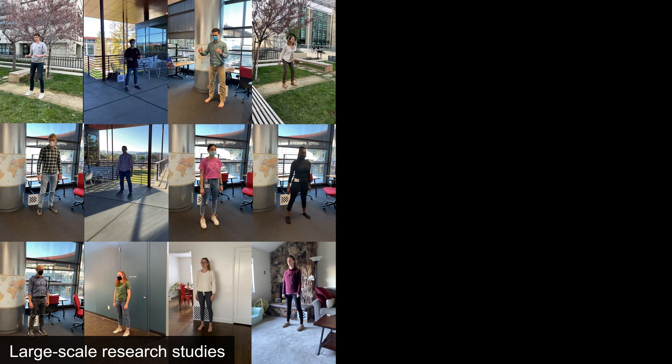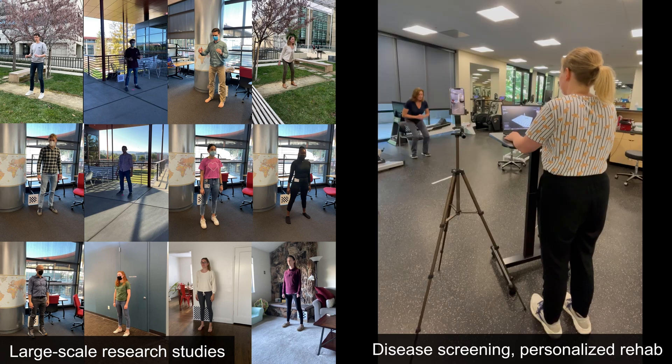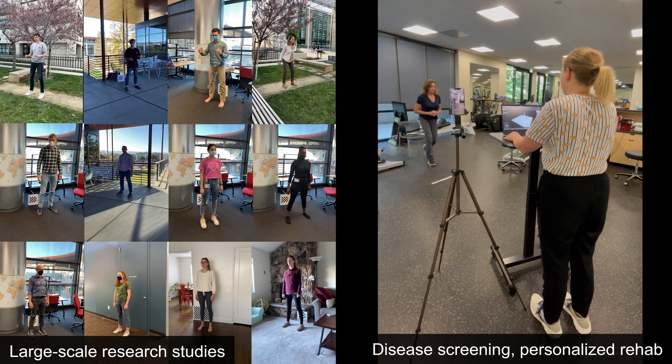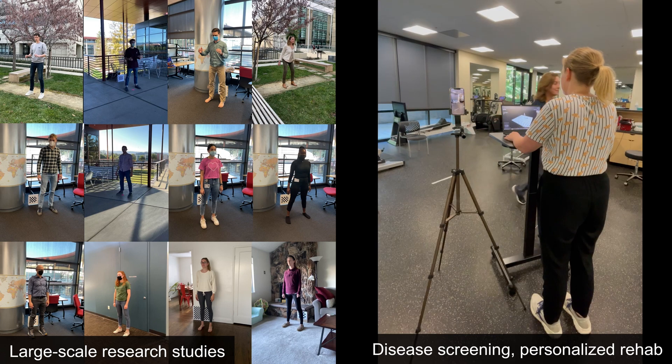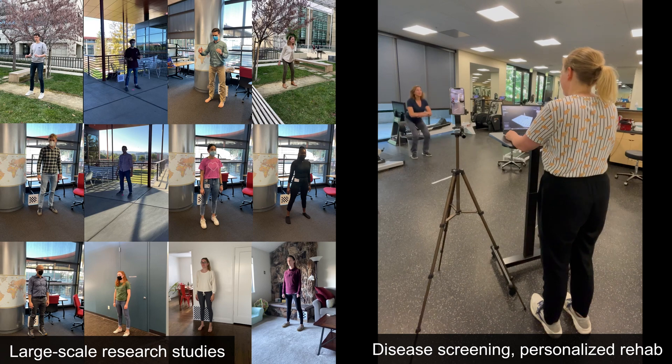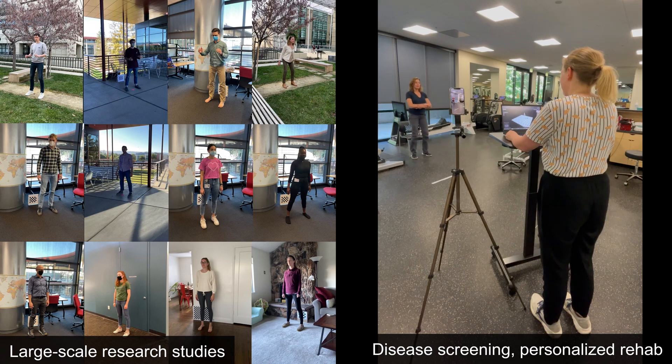By reducing the cost, time, and expertise needed to measure movement, OpenCap enables large-scale field studies that are powered to predict rare events like injuries. Movement biomarkers can then be translated into clinical practice for applications like fall risk detection and personalized rehabilitation.